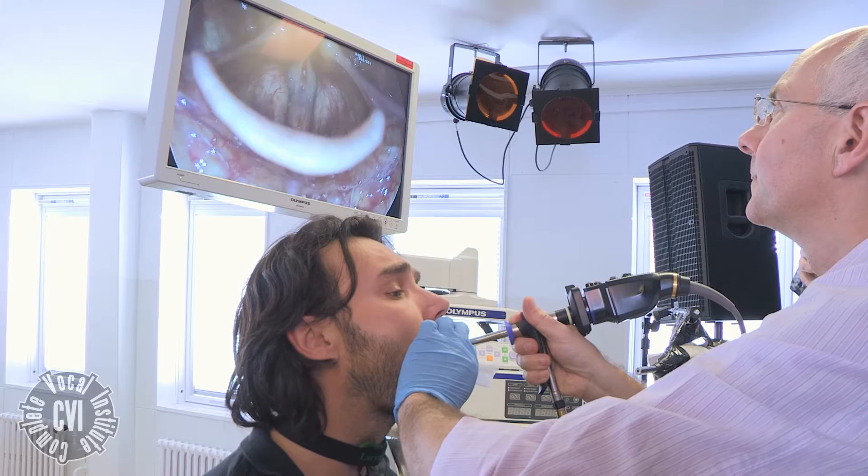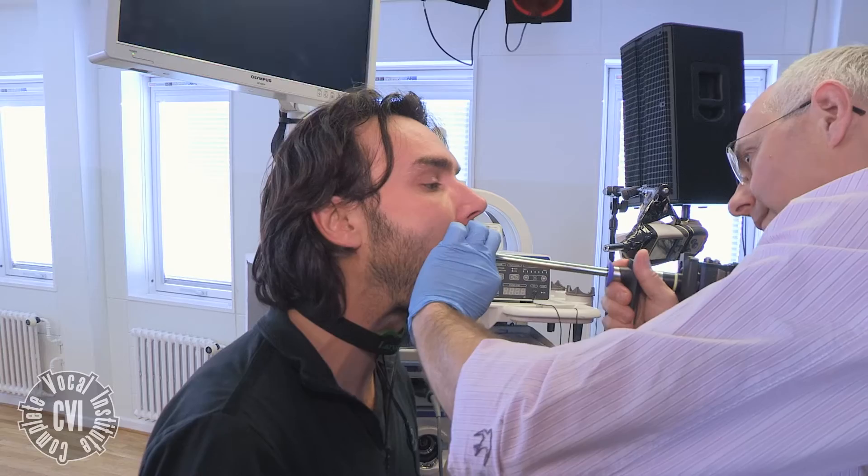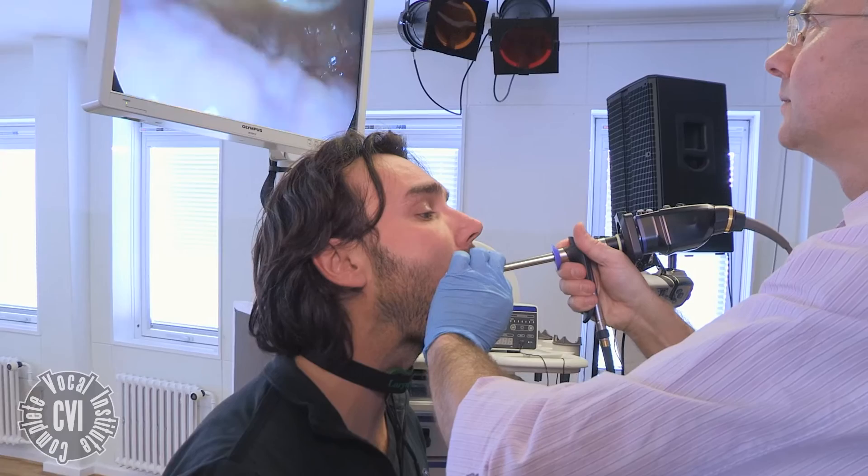We have two types of telescope. We have a rigid telescope and we have a video naso-endoscope. The rigid telescope is actually inserted through the mouth and I hold the tongue. It has a little lens which is angled at 70 degrees, which just rests at the back of the throat and looks down onto the vocal cords.